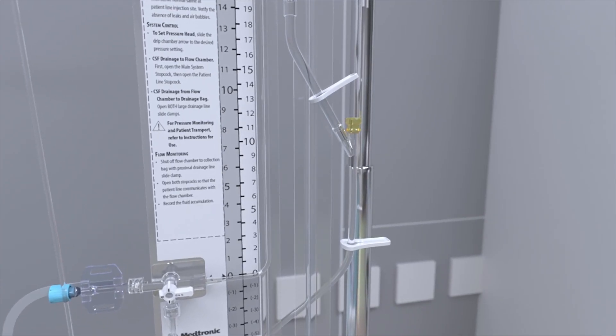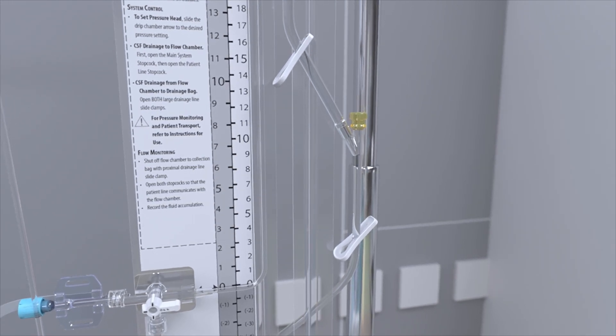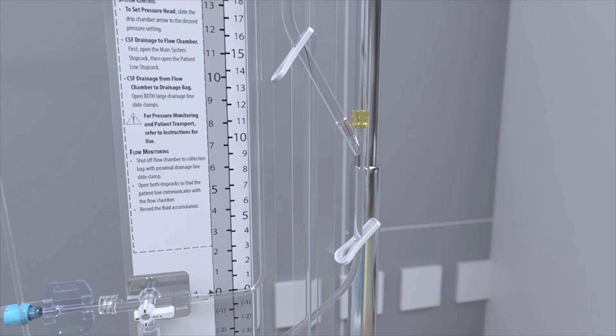Once complete, shut off the flow of fluid from between the drip chamber and the drainage collection bag by sliding the clamps over the tubing pinching off flow, or rotate the stopcock below the drip chamber if included.